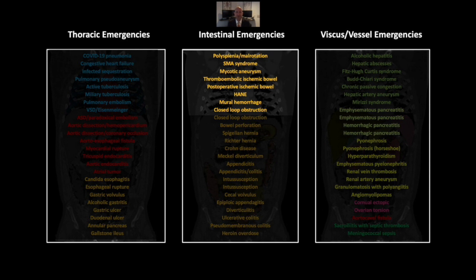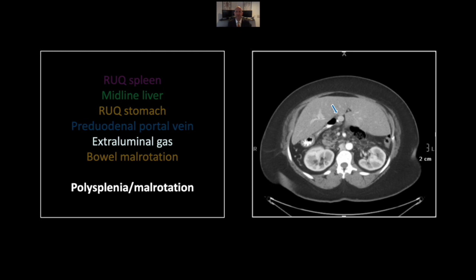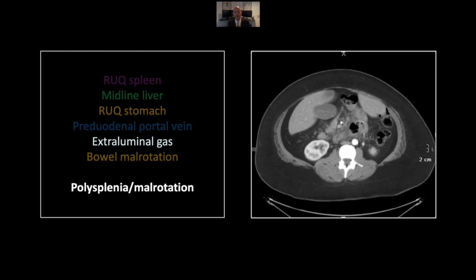We'll start with a case of polysplenia with malrotation and perforation, as is frequently the case with these cardiosplenic syndromes. There is a right upper quadrant spleen that is multilobulated, a midline liver, and there is the gastric fundus in the right upper quadrant. A little lower down, you can see the characteristic pre-duodenal portal vein. Note its relationship to the duodenum, which is coming across from right to left. There is a focus of contained extraluminal gas, probably retroperitoneal.